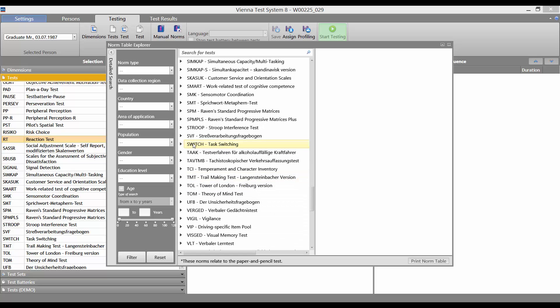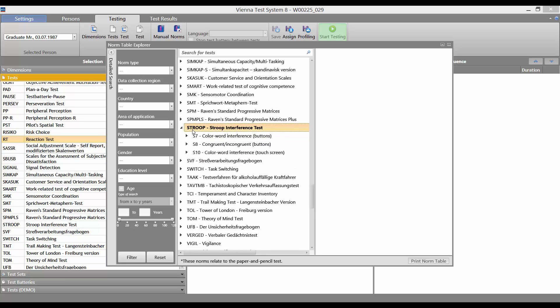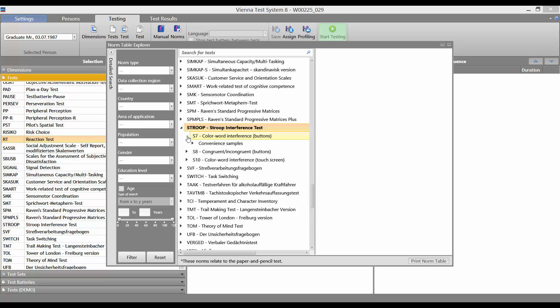In the Norm Table Explorer, you can then select your required test with the associated test form again if you need to.